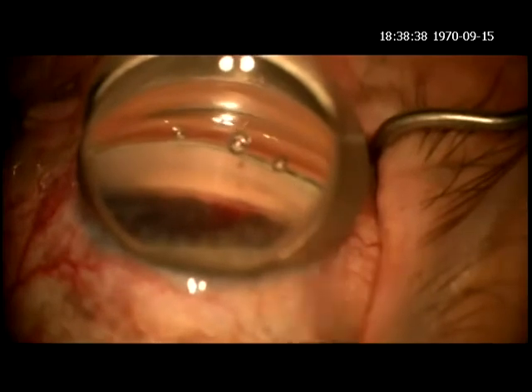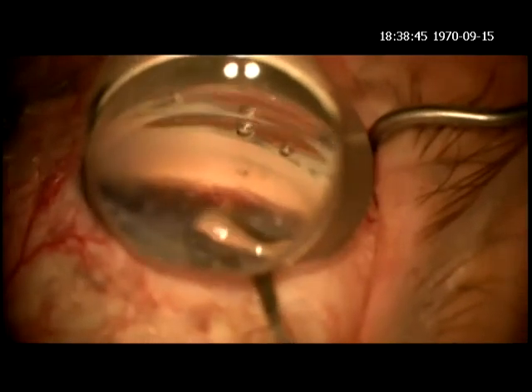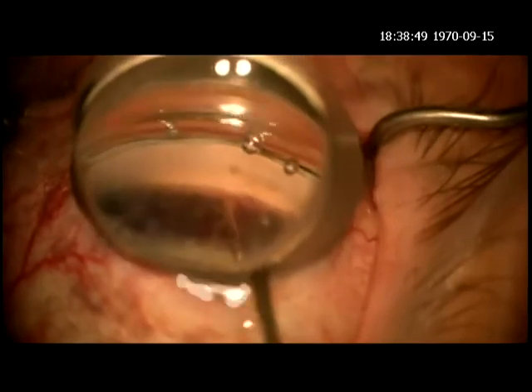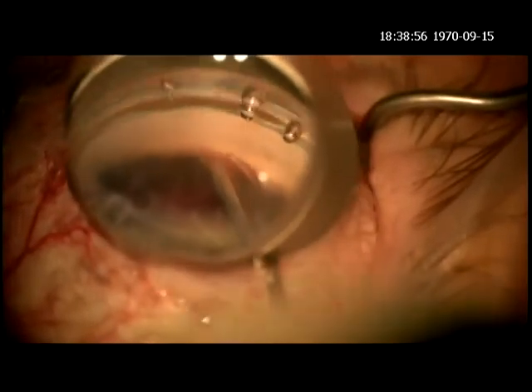So you can see the moment that the Cypass passes into the supraciliary space just above the ciliary processes, and you'll see it go through right there. And at that point, it's basically a routine Cypass insertion.